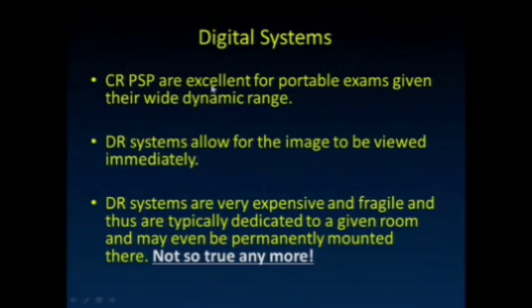CR photostimulable phosphors are great for portable exams. You take them up, image them, bring them back. They have a really wide dynamic range. Digital systems allow for the image to be viewed immediately at multiple locations. And we used to say CR was nice for those portables, you know, you go up, shoot them, bring it back down, those kind of things.